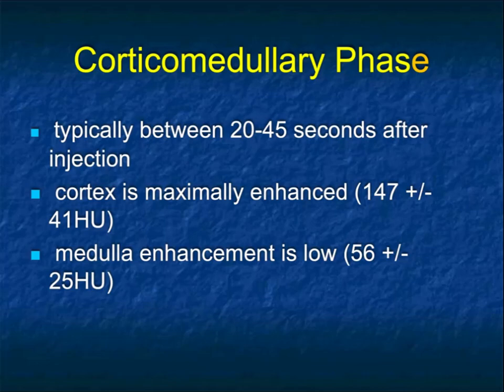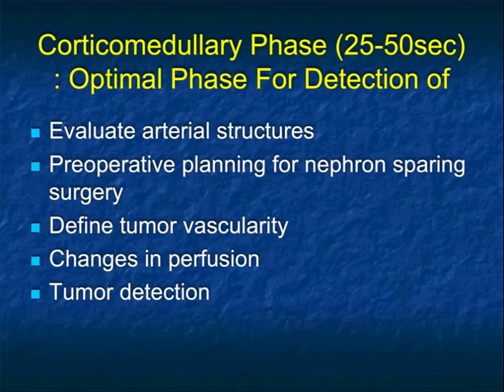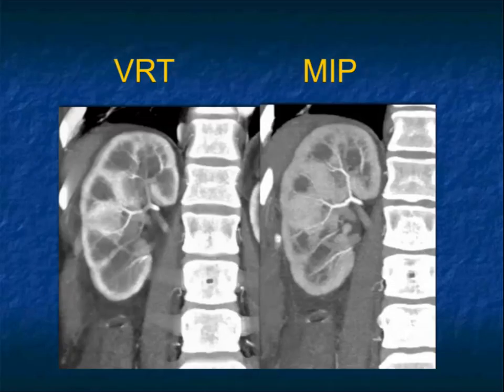In the cortical medullary phase, the cortex is maximally enhanced up to about 150 Hounsfield units and medullary enhancement is relatively low, with a difference of about 90 Hounsfield units between cortex and medulla. It's ideal for looking at arterial structures, particularly the renal arteries, excellent for preoperative planning, defines tumor vascularity, and is the best phase for distinguishing papillary from clear cell renal cell carcinoma. Changes in perfusion due to vessel narrowing or occlusion may also be best seen in this phase, and tumor detection at times will only be visible in the arterial phase.